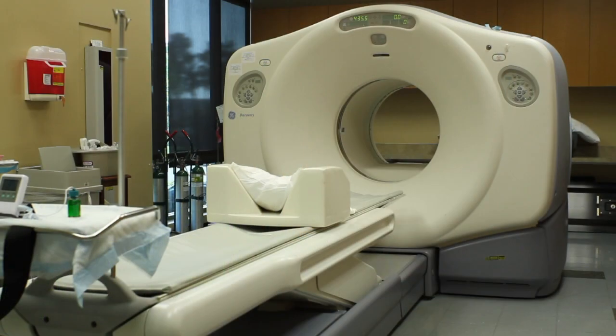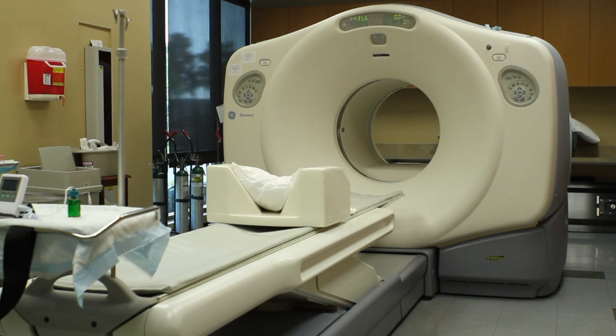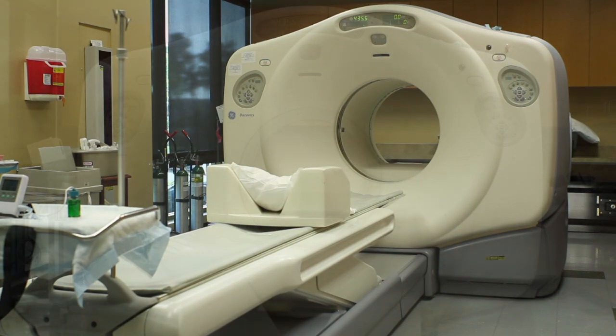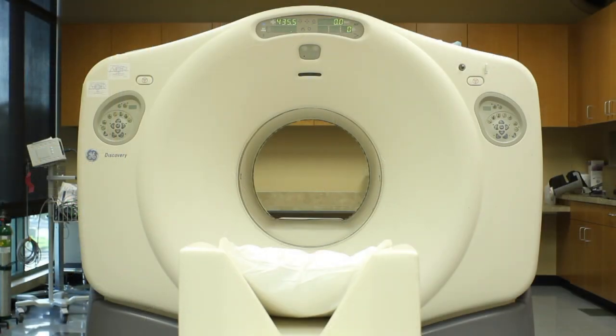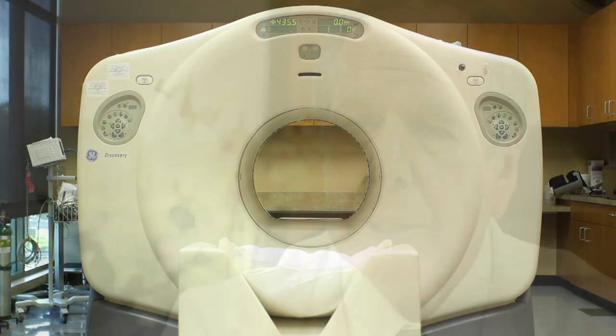When your waiting period is finished, you will be taken into our scanner. You do not need to remove your clothes, will not be asked to hold your breath for long periods of time, and will find our scanner very patient-friendly. It is not a tunnel design like MRI scanners. On average, the pictures take about 30 minutes and depend upon the exact scan ordered and your height. We will monitor you the entire time and converse with you as we go.